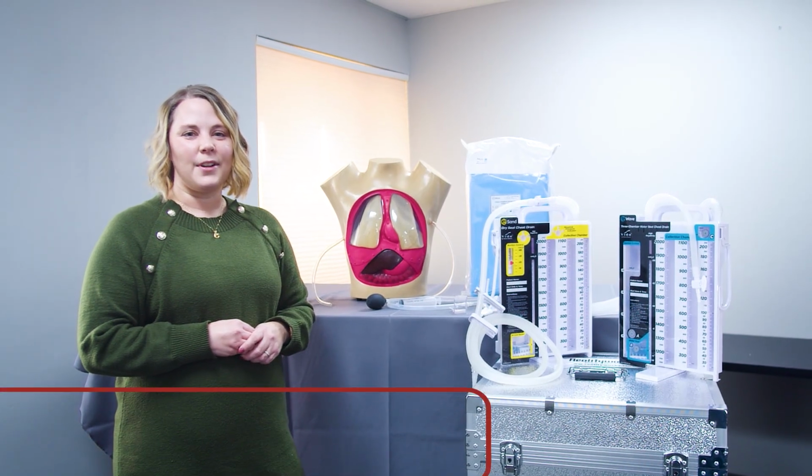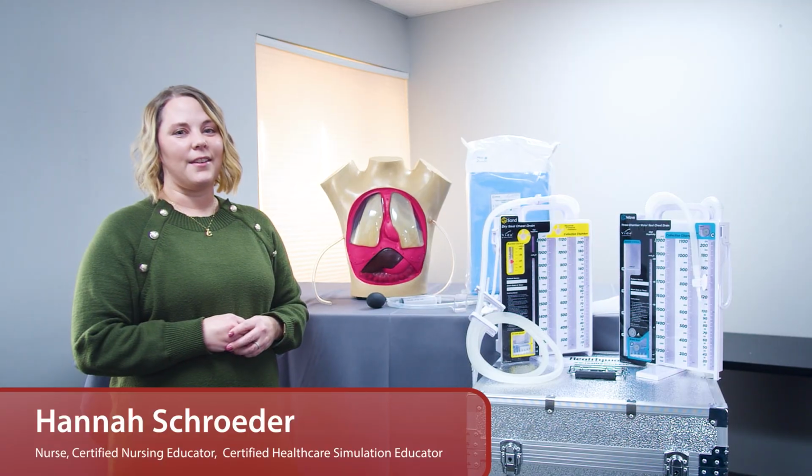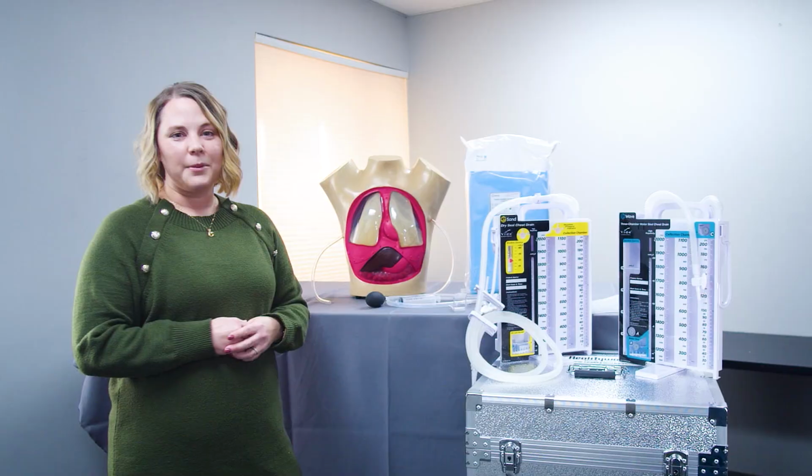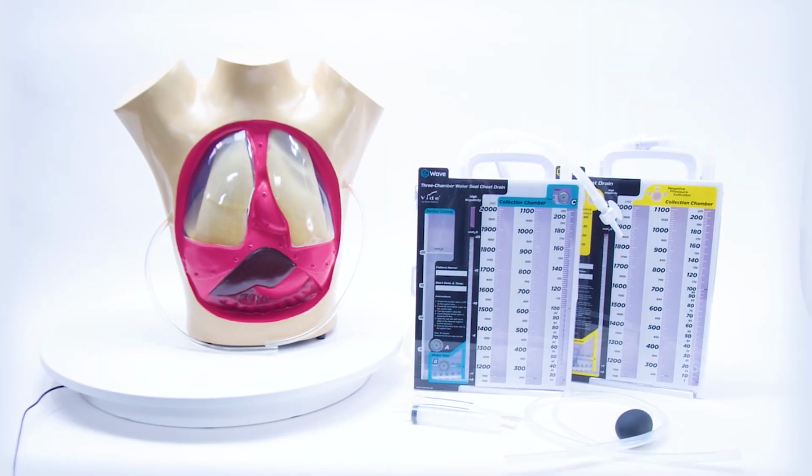Hi, I'm Hannah Schroeder. I am a nurse and a certified nursing educator and certified healthcare simulation educator, and I'm really excited to present to you the Realityworks chest tube management system.